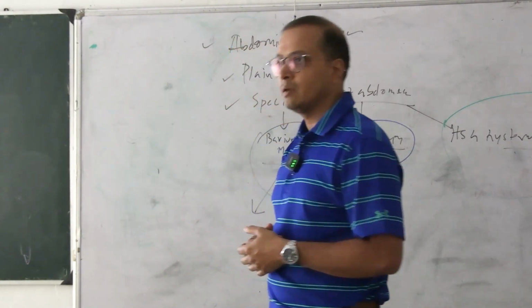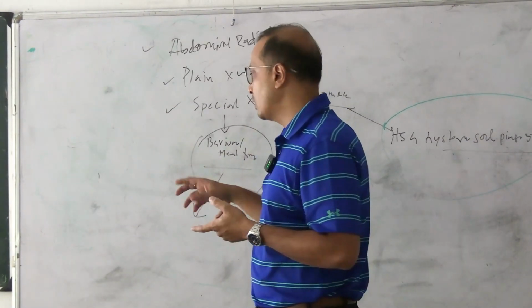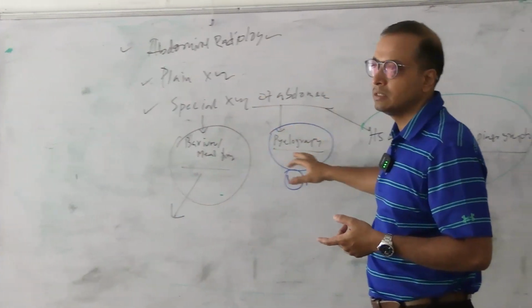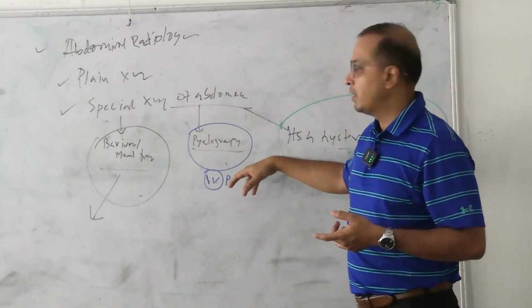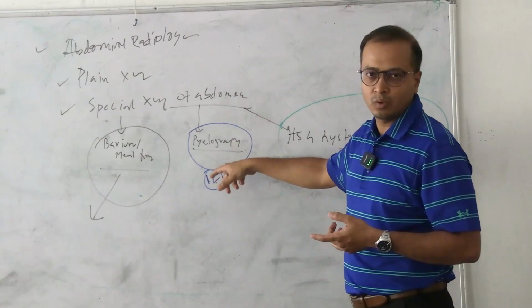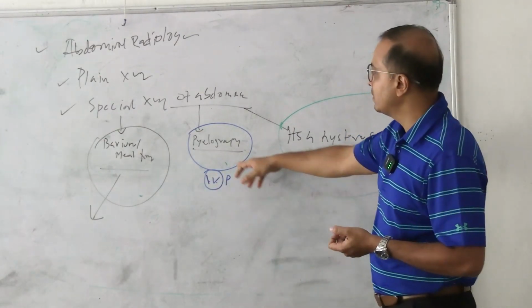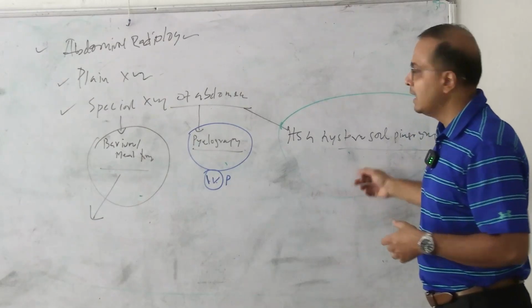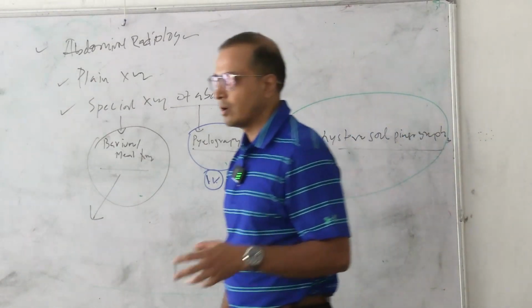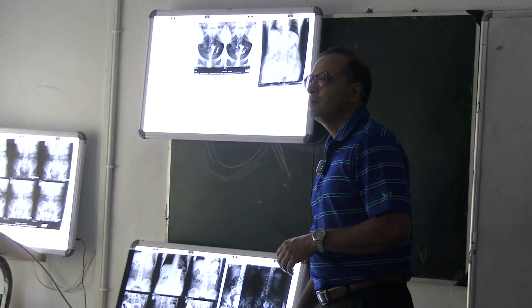And if it is special, what kind of special? What special thing are we highlighting? Barium swallow or meal; or if you are going to see the kidney system, pyelogram, what we have is the intravenous pyelogram, in short IVP. IV means intravenous. The dye is given the intravenous way. HSG, Hysterosalpingogram or Hysterosalpingography, is where you are going to see the birth tract system.